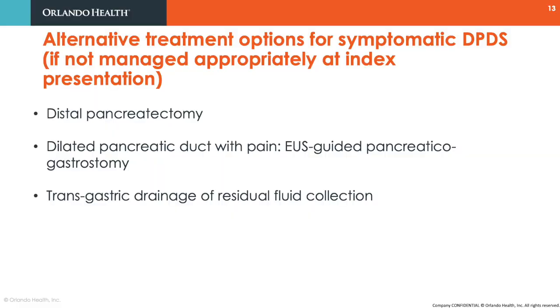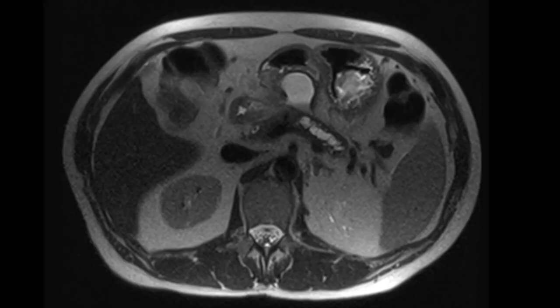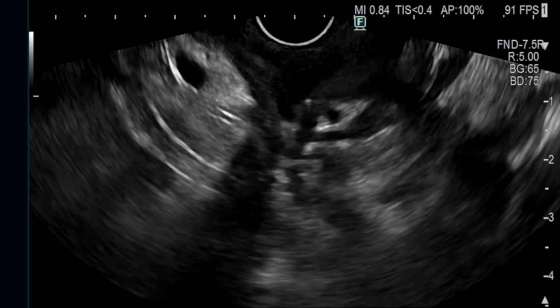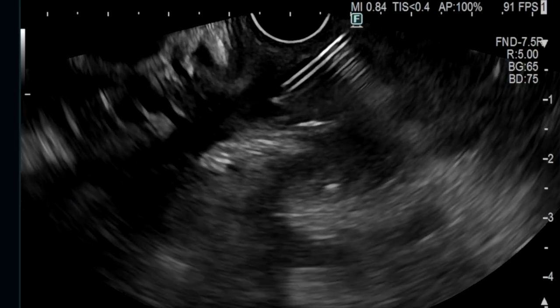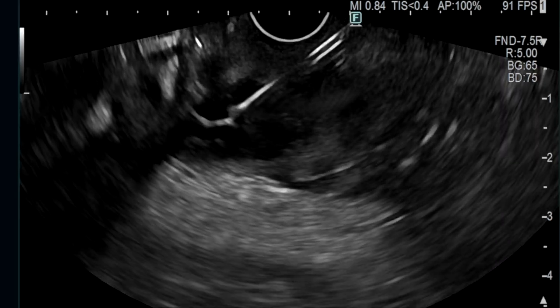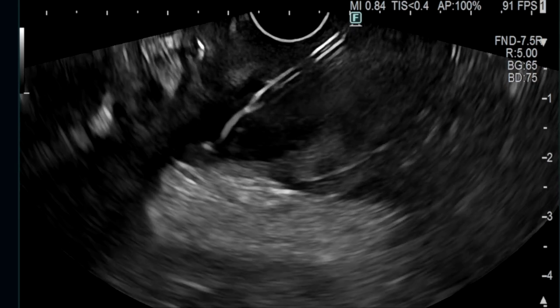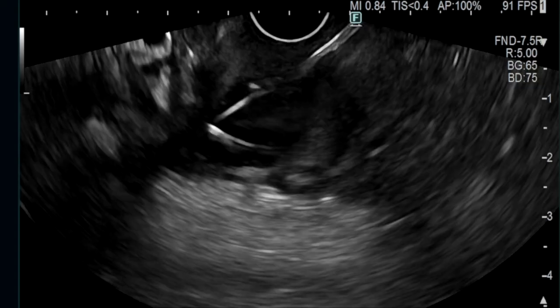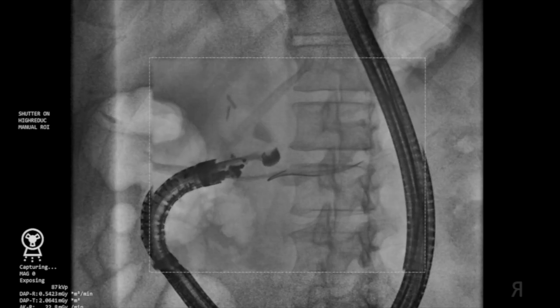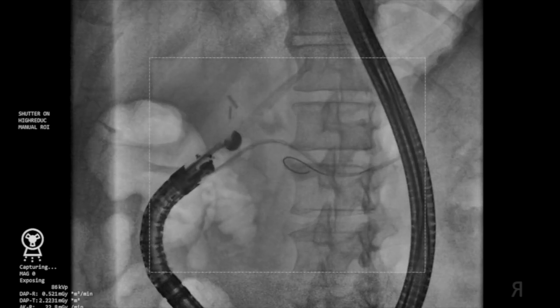In patients with small residual collections, after instillation of water into the free space that communicates with the main pancreatic duct, an EOS-guided transgastric stent placement can be undertaken. However, all of these options can be technically challenging to perform. In this patient with a small 2.5 cm-sized residual collection, the small collection was punctured using a 19-gauge FNA needle, and water was instilled into this area to expand the collection. An angled 0.025-inch guide wire was then inserted through the needle and into the collection. The tract was dilated, and a double pigtail plastic stent was inserted into the collection.